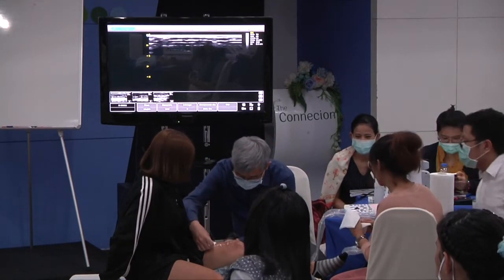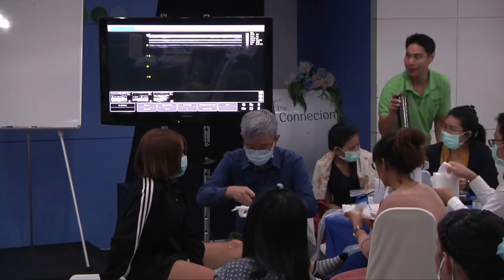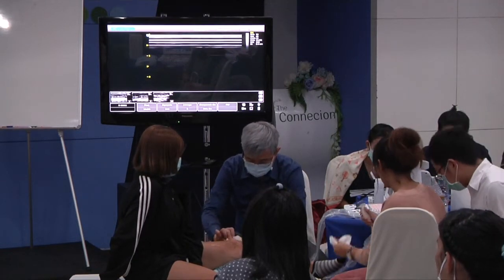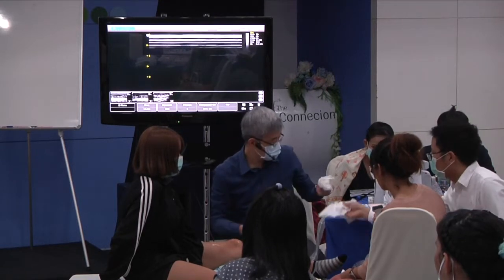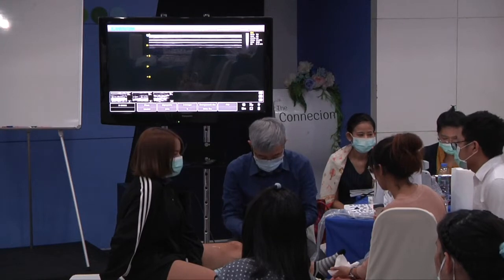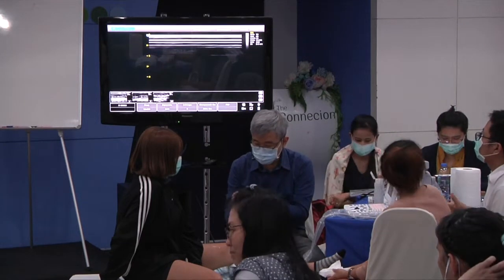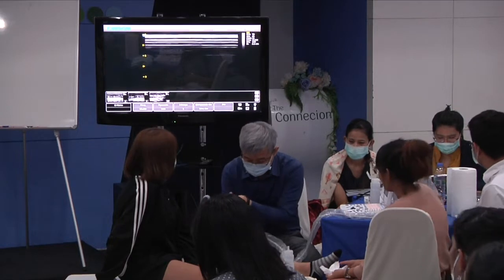I know you practice a lot, so sometimes we don't really need a lot of gel. Cool, thank you. I know you can watch the TV behind me, so I'm going to review some work with you.